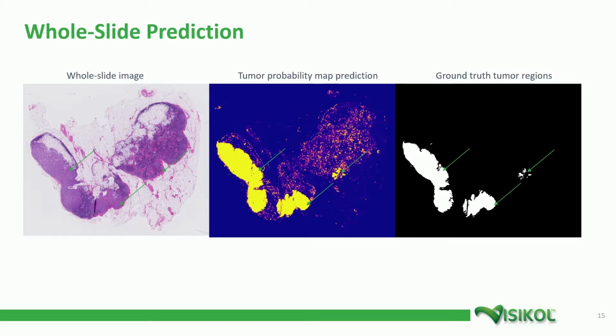To fix this, we would retrain our network using a modified loss function where we penalize false positive predictions more than false negatives. This would ensure a low false positive rate during testing time. We could also do the same thing if we were more concerned with false negatives. However, for this demonstration, we equally penalize both wrong forms of prediction for simplicity.